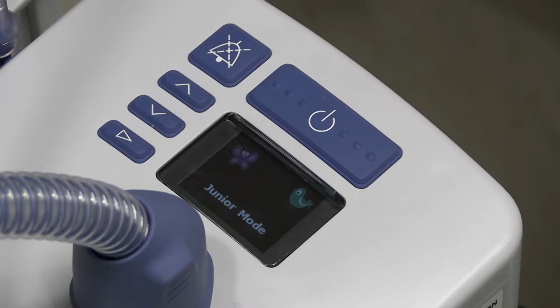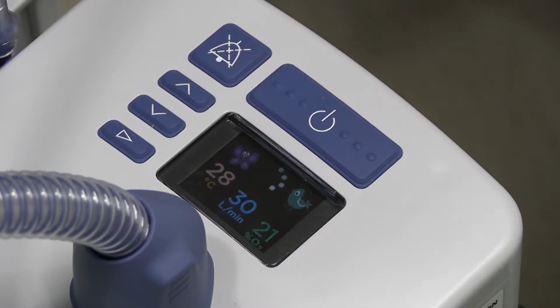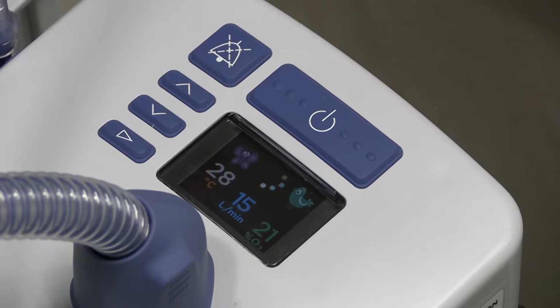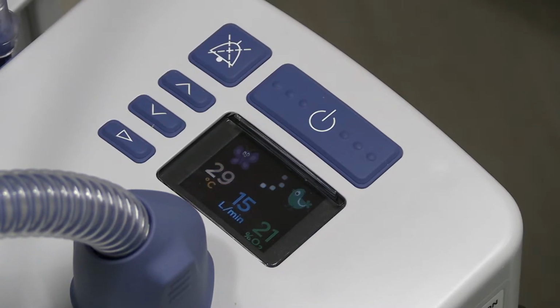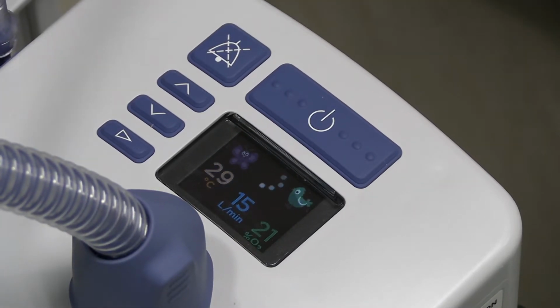And now you'll see it chimes and then shows you that it's now in junior mode. The other indication that we're in junior mode is the butterfly and birdie icons on the screen. We are continuing to warm up as we're seeing the circling star sun on the screen here. But also, you'll notice that on the screen, with the junior mode switchover, it said that there are new target values set in this mode. And you can see right now the new target value is set for 15 liters per minute, with still room air being delivered, and we are now warming up and we are at 29 degrees Celsius.